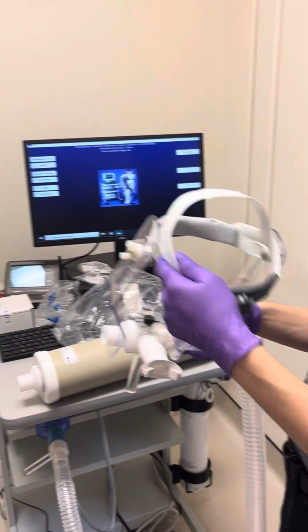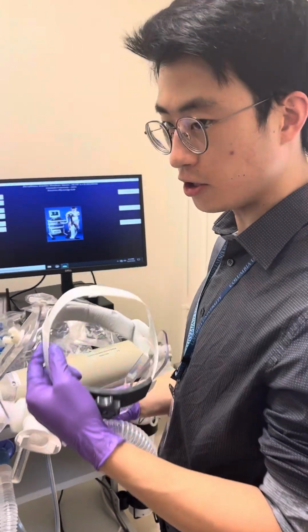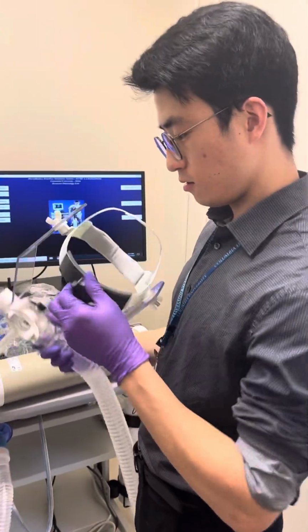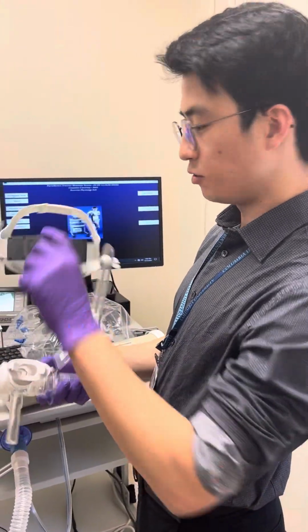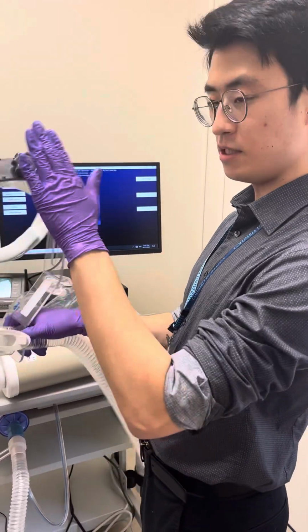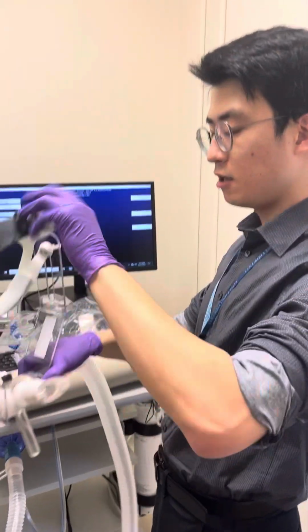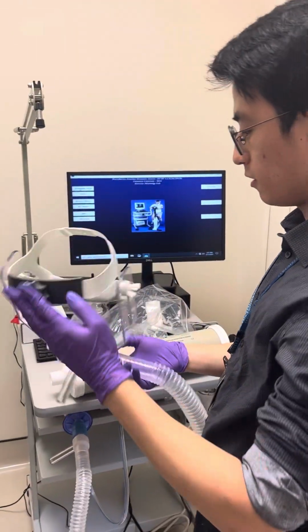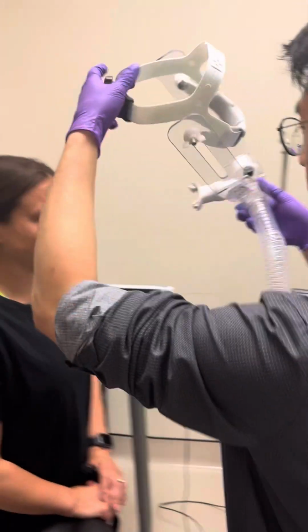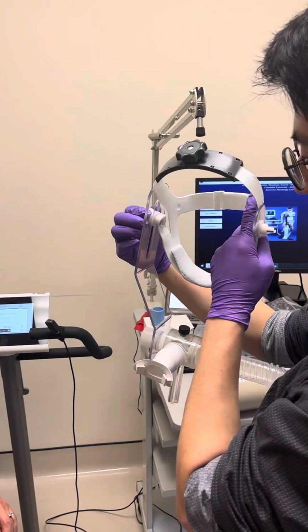To fit the headgear, before actually proceeding with the exercise, I think you should fit the headgear first. So make sure this is loose, and this is the back, kind of like a bicycle helmet. So you fit this, make sure it fits pretty well, and I'll demonstrate on Katie right now. And the other thing you want to do is have these two screws loosened.